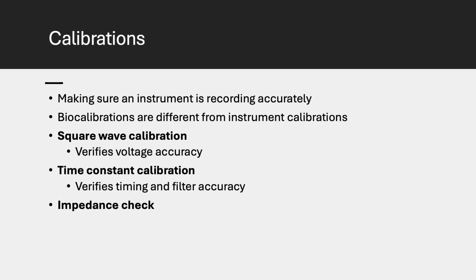An impedance check is not really a calibration, but it does verify that the electrodes have a good connection. When on, the impedance check produces an electrical stamp on the record, the actual sleep study, and shows the contact impedance values of the applied electrodes, and it documents the actual values in kiloohms.